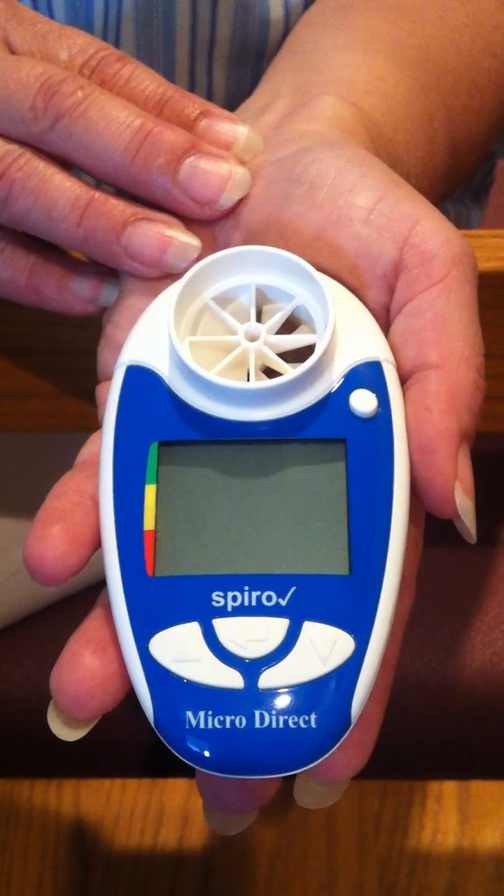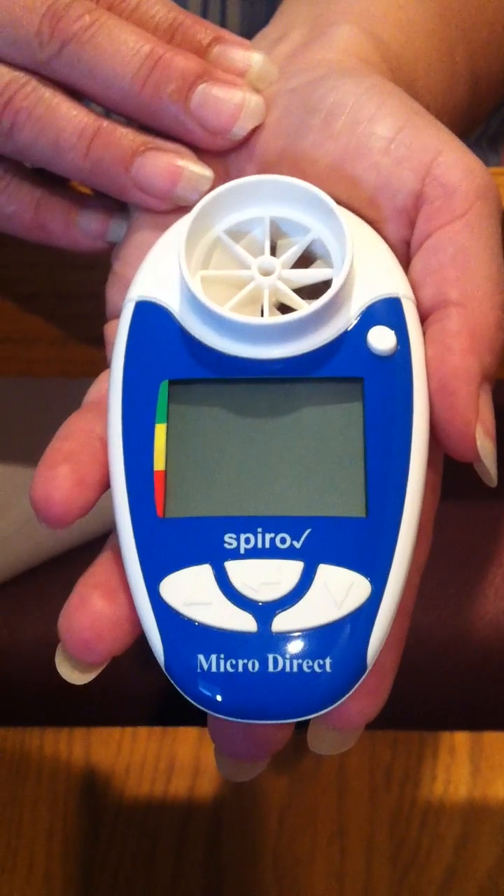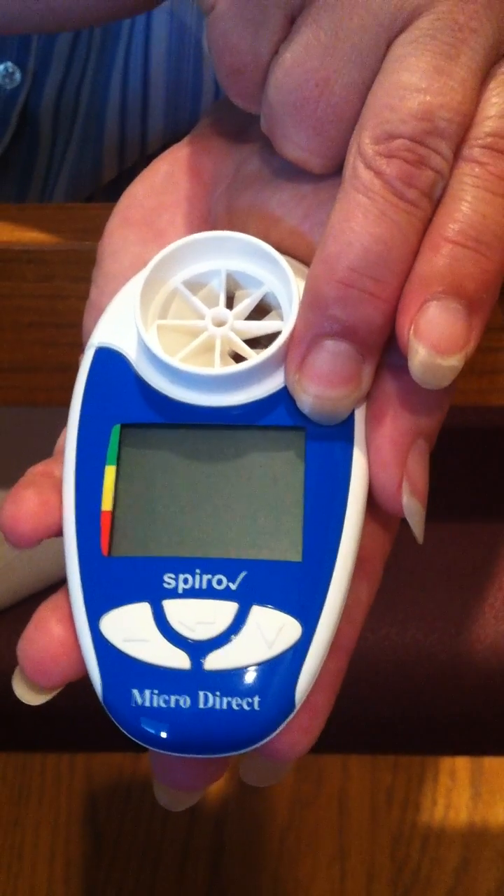Today we're going to show you how to operate and perform a test using the MicroDirect SpiroCheck Spirometer. You turn the SpiroCheck on by pressing the white button at the top right.